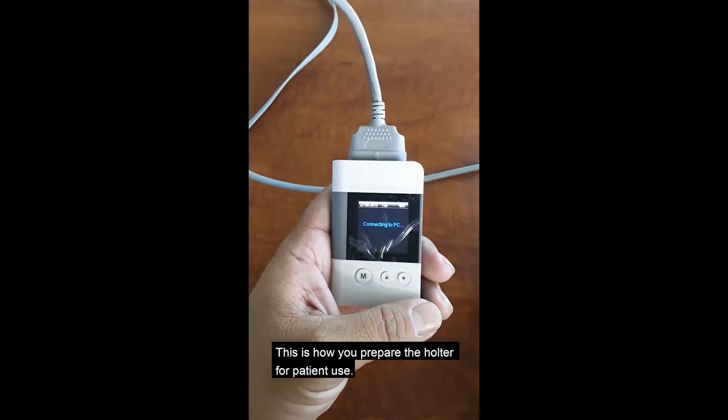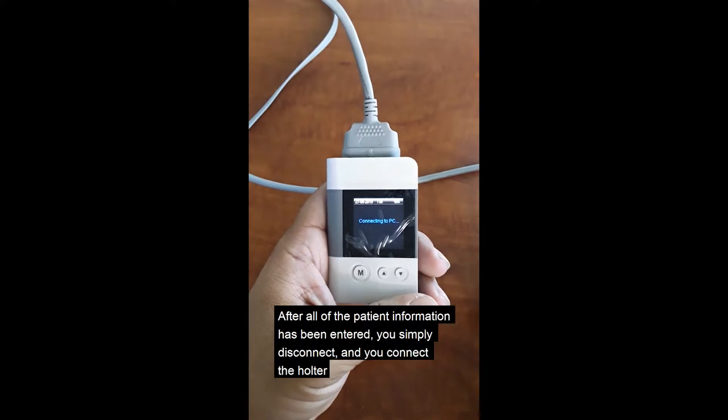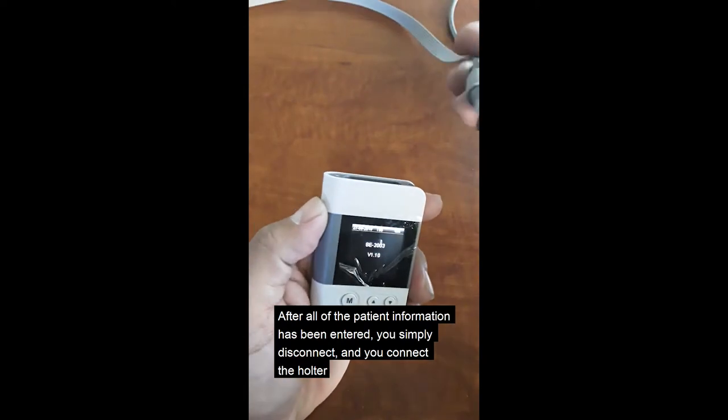This is how you prepare the holter for patient use. After all the patient information has been entered, you simply disconnect, then connect the holter.